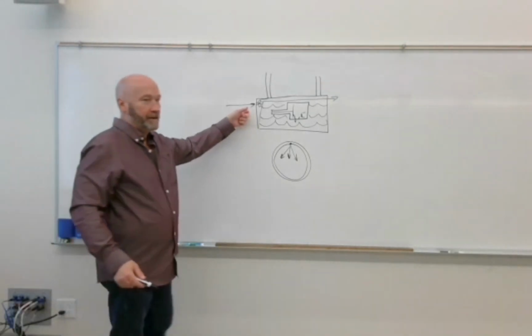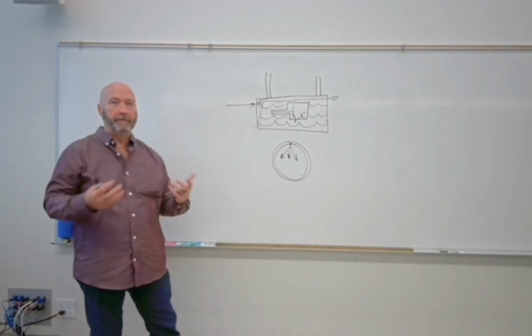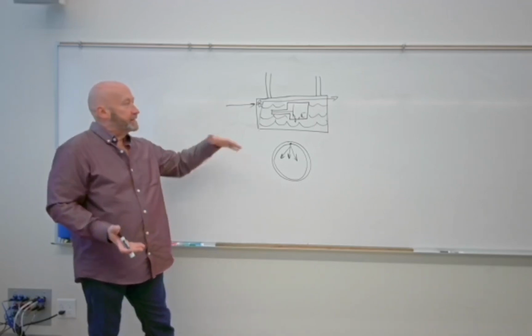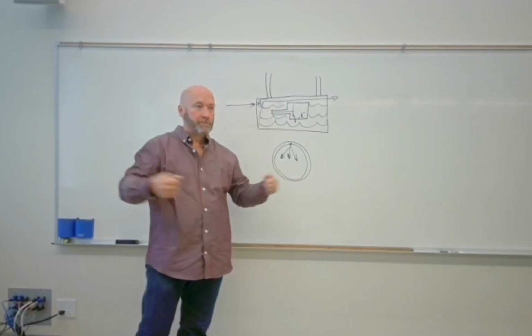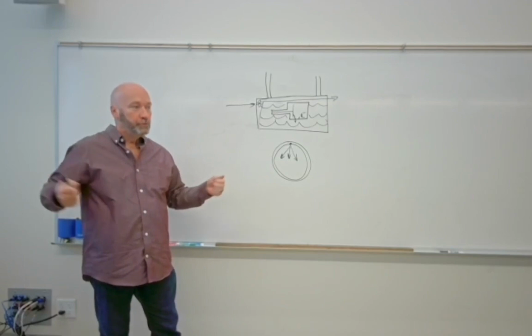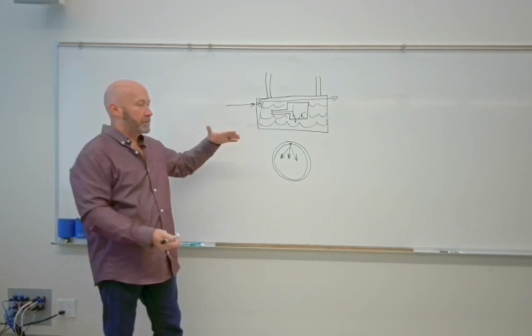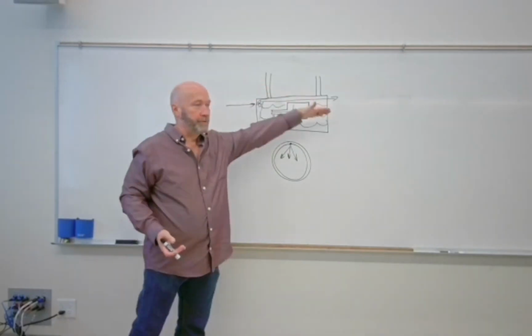The fan might not truly be a fan. It may be what they refer to as a bellows type apparatus. So what that does is as the air heats up, it kind of compresses a bellows. A bellows is one of those things that you can stoke fire up with, right? So it compresses as the air rises and it pushes the air out.